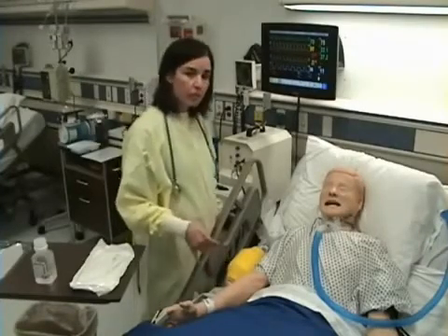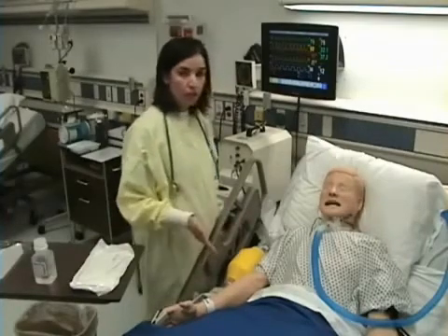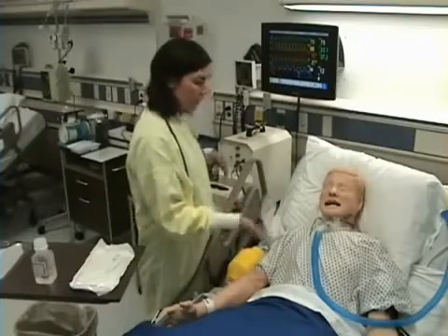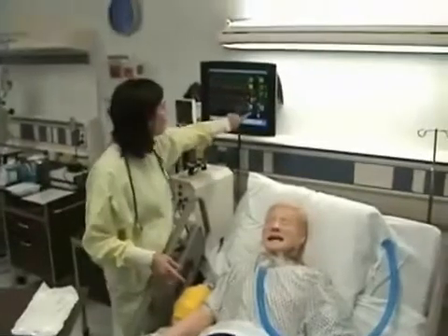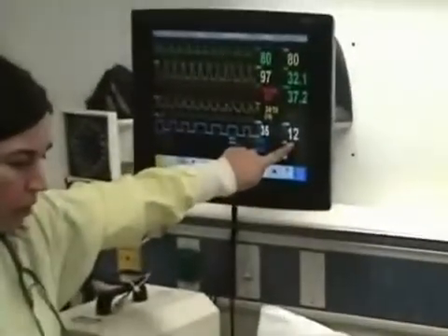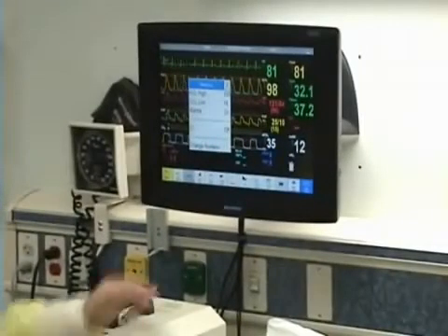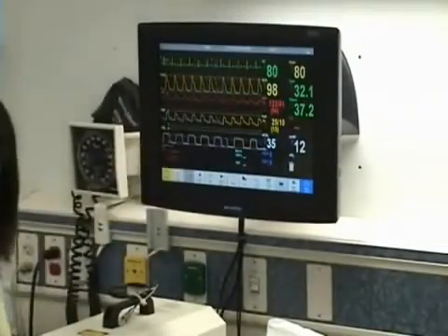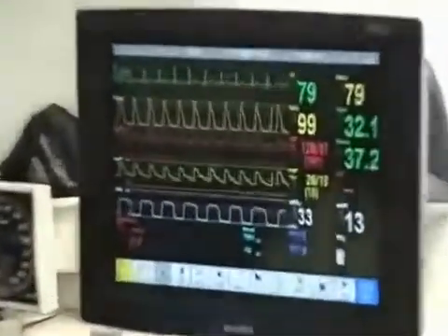I want to do a full respiratory assessment on my patient before I suction them. I'm going to check their respiratory rate, which I can measure using my watch, or I can check on my patient's monitor, and his respiratory rate is 12. My patient today also has continuous pulse oximetry. The pulse ox probe is on his finger, and I am able to monitor this value on my monitor as well.